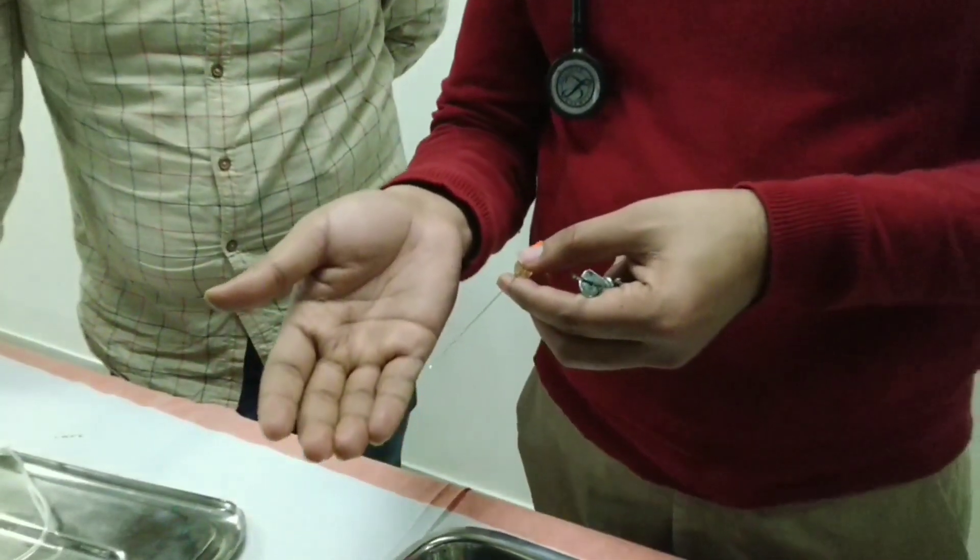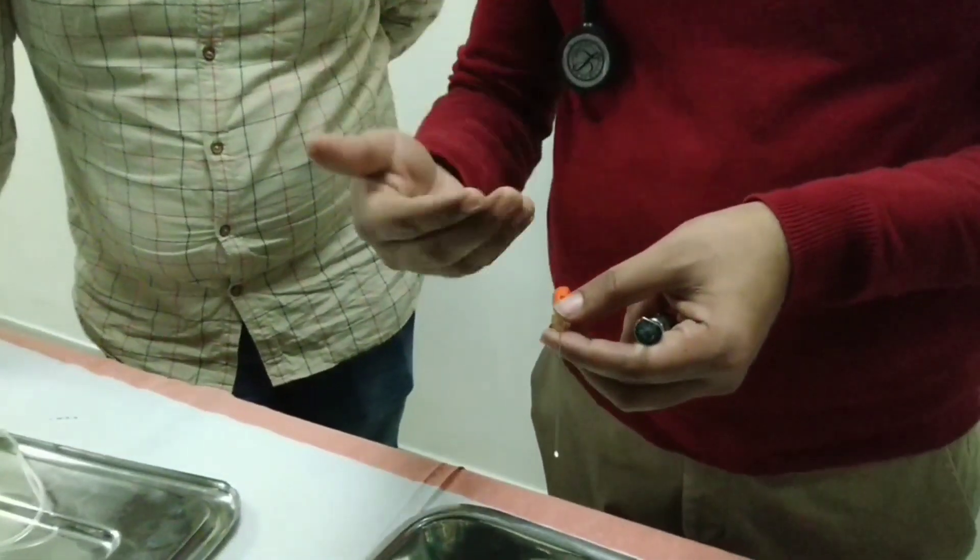Once I am in the CSF subarachnoid space, I will remove the stylet. And now the fluid will come out.